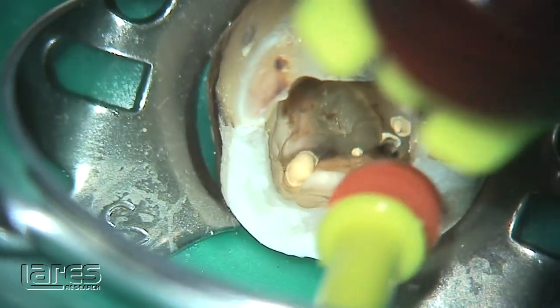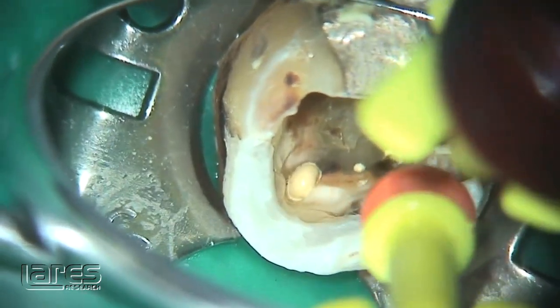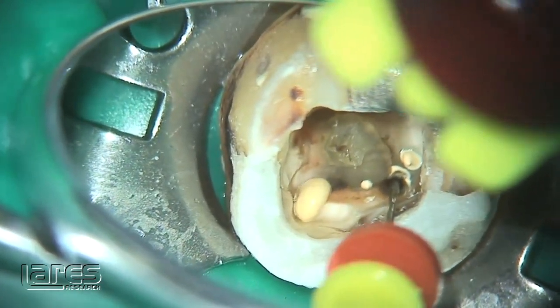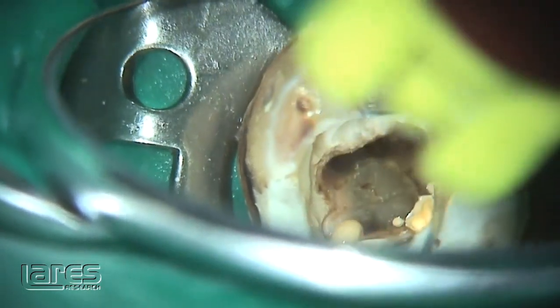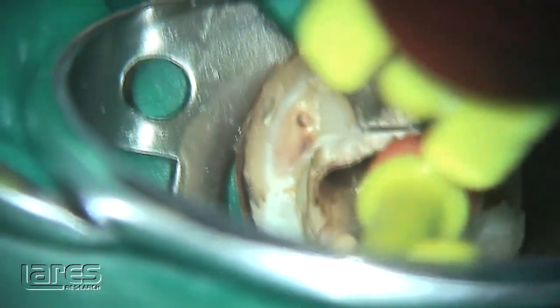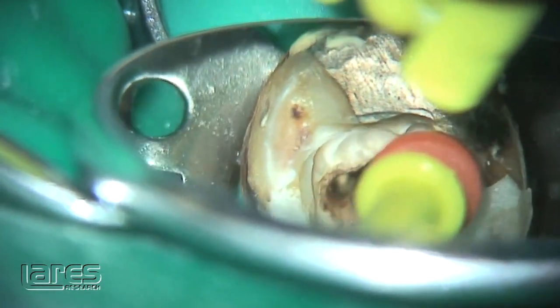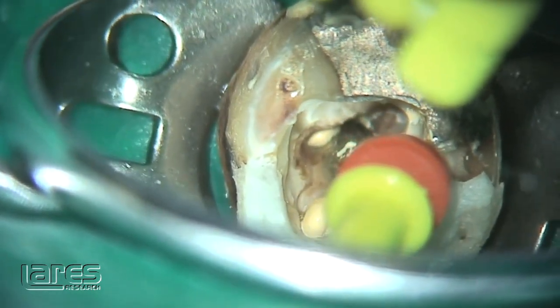This was one of the first teeth I ever did where I saw these anastomoses — filling the mesial buccal canal of a lower molar and watching it come up the mesial lingual of a lower first molar. Then I had the same phenomenon happen in the distal canal, and it just blew me away. I had never really experienced that with conventional methods, but when I started utilizing the laser and PIPS, I've seen this routinely.